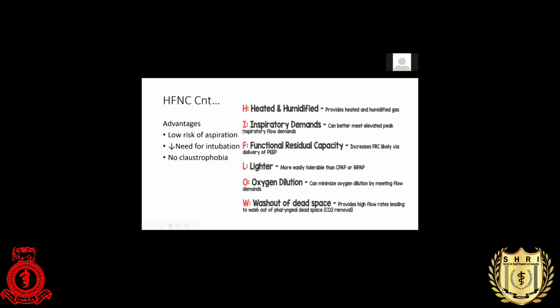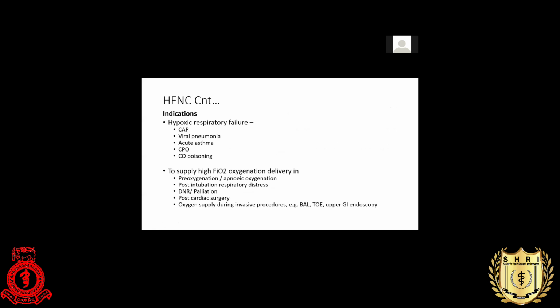And when we go to the advantages of high flow nasal cannula, the main advantage is low risk of aspiration, and it will reduce the need for intubation, and there is no claustrophobia. If you are going to put on a CPAP, the patient has a fear of that because of the claustrophobia.